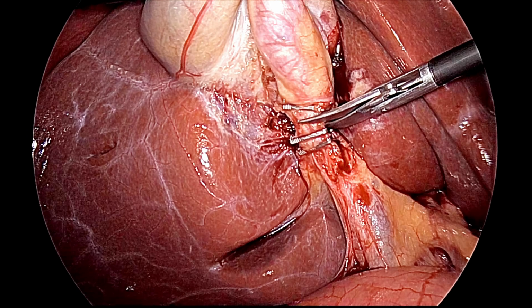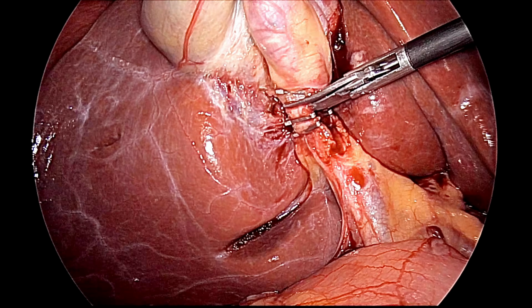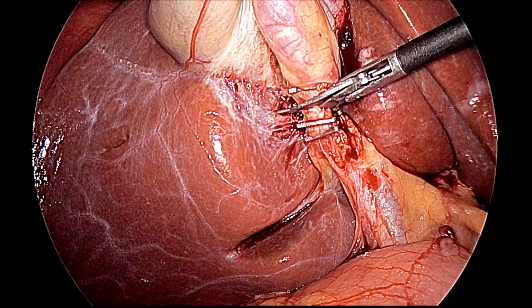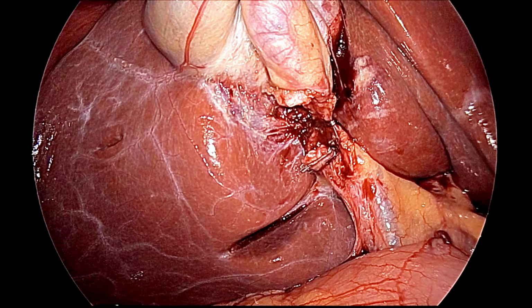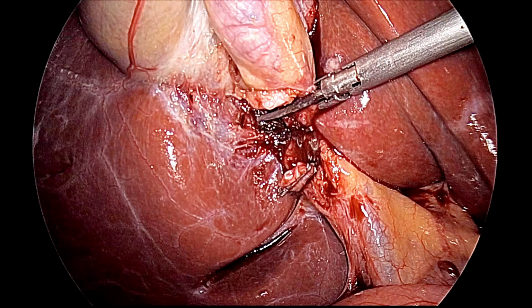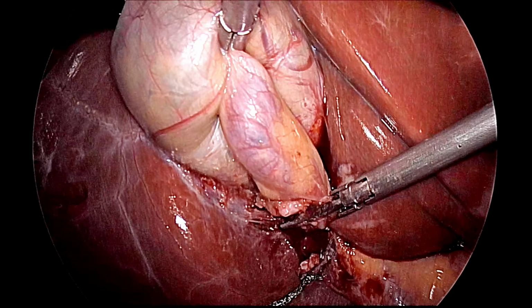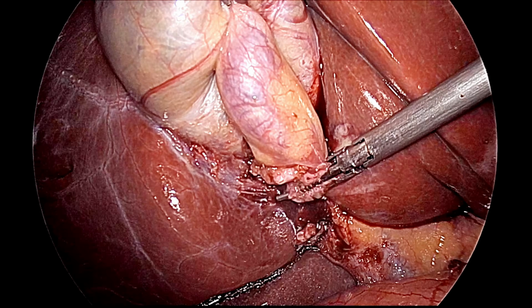You can use harmonic also, but direct touching of the harmonic to the clip should be avoided. And that's why these are the scissors which are cutting the cystic duct. And with the harmonic, you can coagulate the cystic artery just above the clip which you have applied over the artery. At that time, you should relax the Hartmann pouch so that the artery will seal.